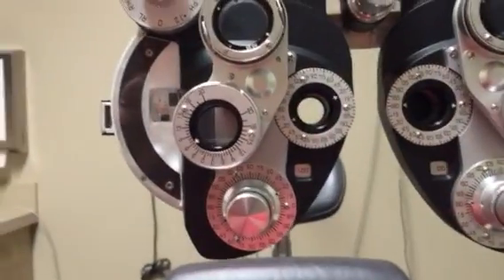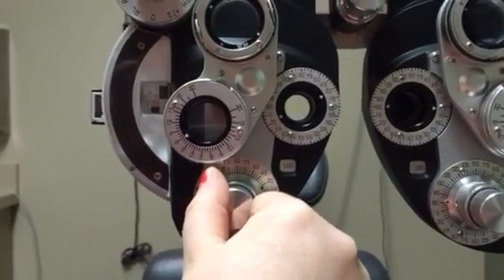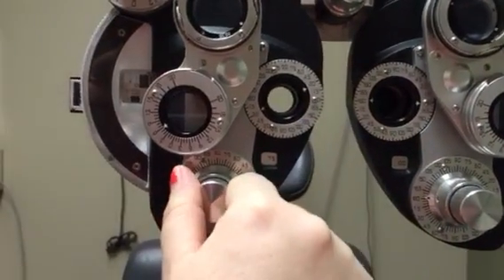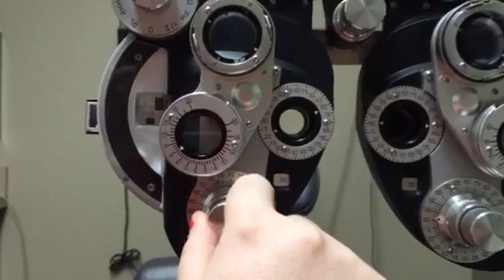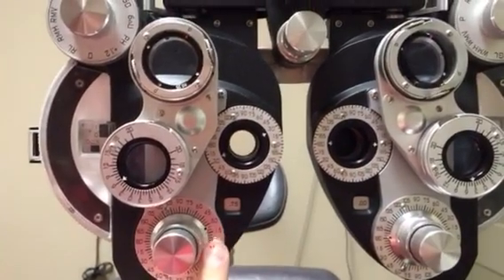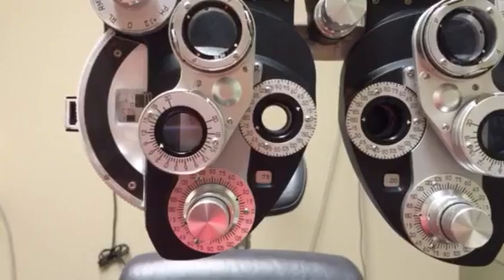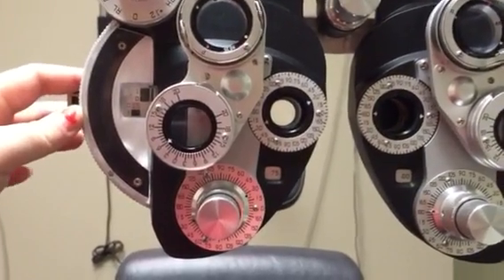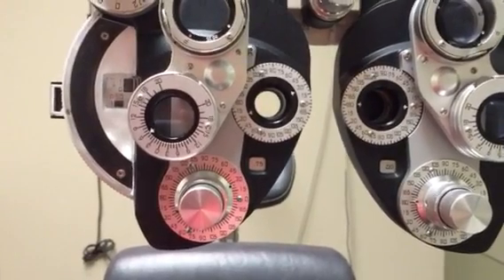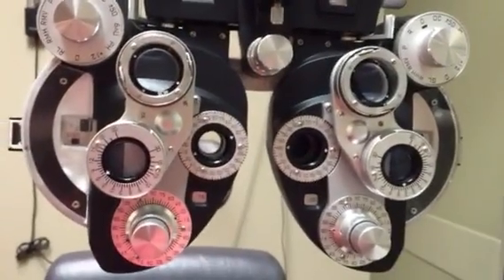Move the Jackson cross out of the way and recheck. With the Jackson cross down, patients sometimes pick up more power than they actually need — it may just look good in the instrument. Back up a quarter and if it's about the same, you can leave them a little less. The final result here is plus 0.75 at 25 degrees. Since two quarters of cylinder were added, you may also need to adjust sphere — often minus a quarter to balance the prescription. Once complete, occlude this eye and repeat the process on the other eye.